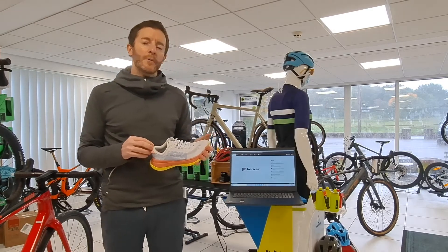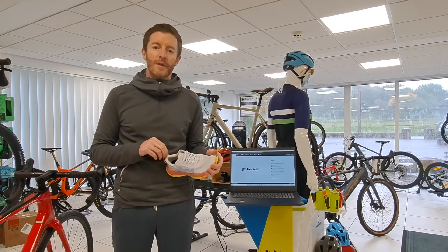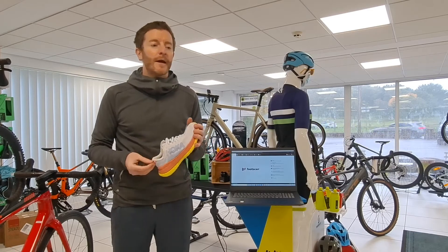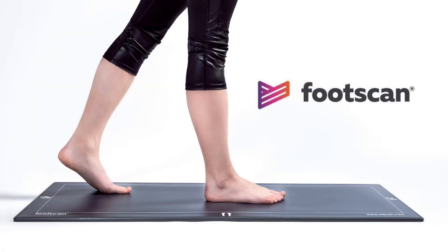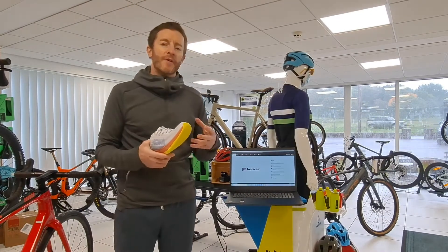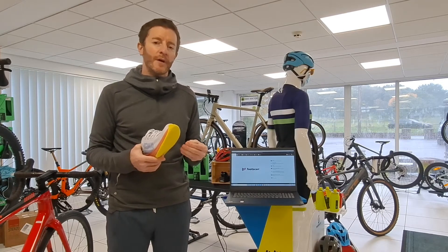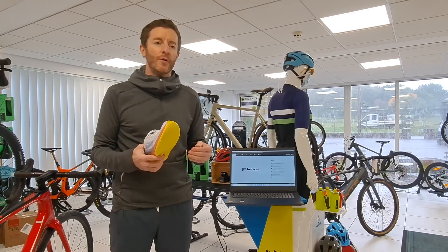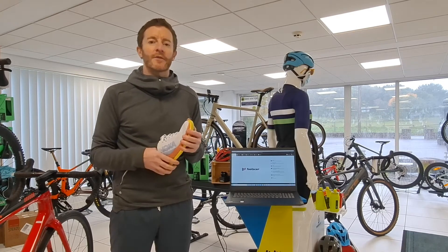So we did a bit of research and looked into where the technology is going with these things. We looked at what other people are using and we came across Footscan, who have developed an awesome piece of software that gives a whole load of information generally only available in clinics. It really gives a depth of information that we can be certain of, so that when we give you the information back as a customer, you can be confident that it is correct.